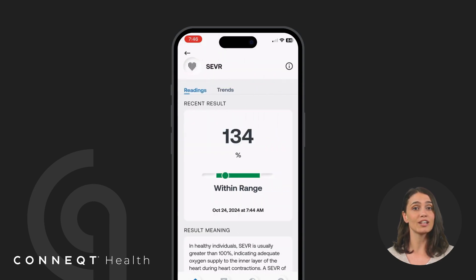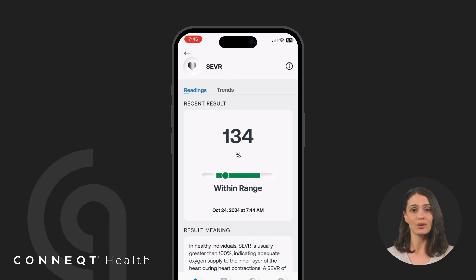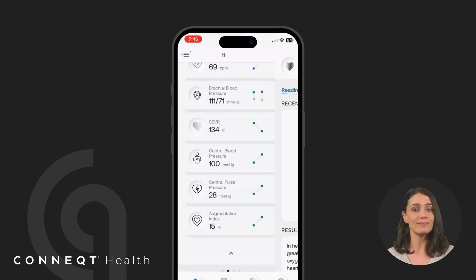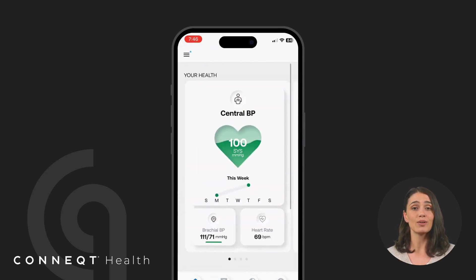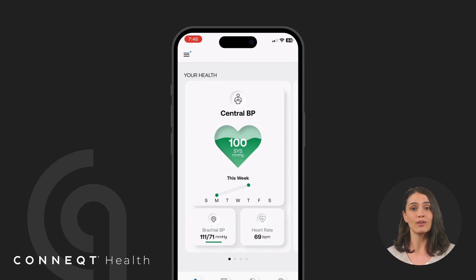Subendocardial viability ratio, SEVR, helps assess the balance between the blood supply to your heart and the heart's oxygen demand, offering insights into your heart's performance under stress. By understanding these metrics, you'll gain deeper insights into your heart health, allowing you to take proactive steps toward better cardiovascular well-being.